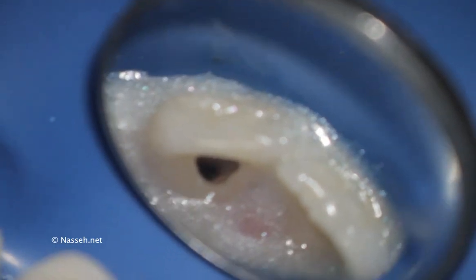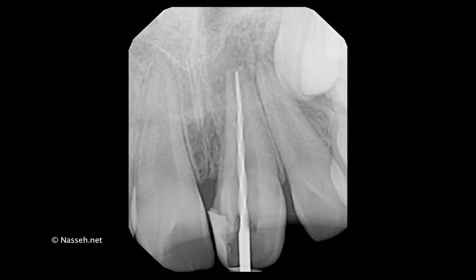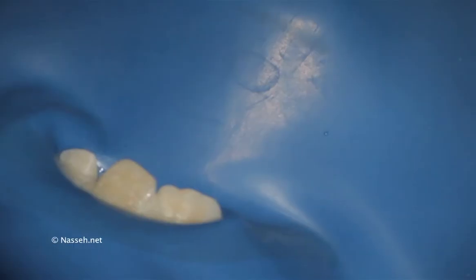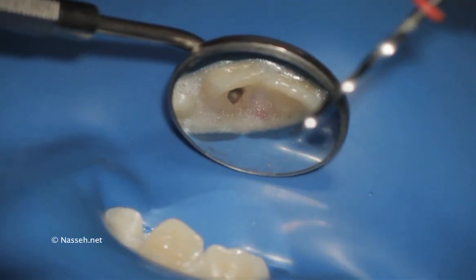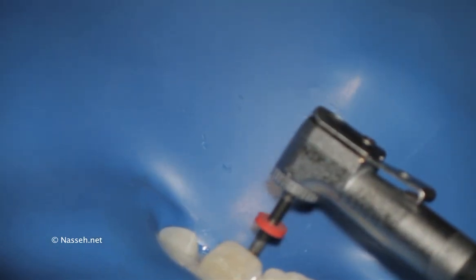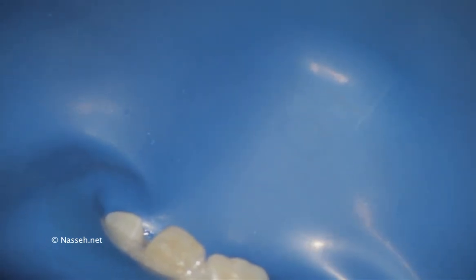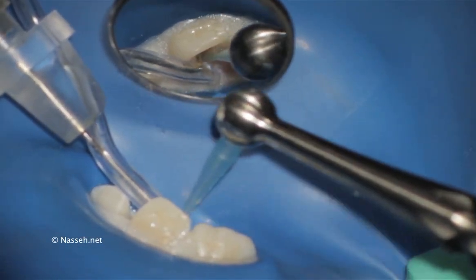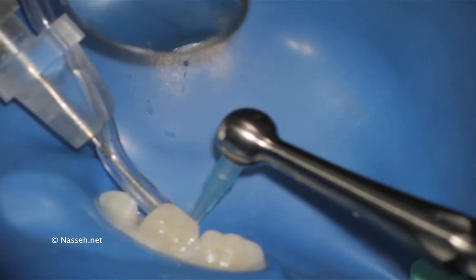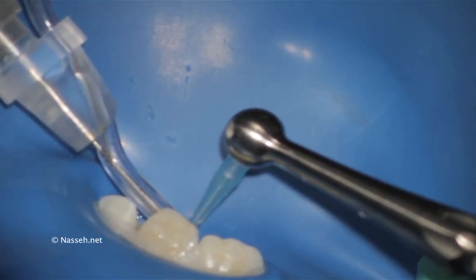Following access and initial instrumentation, a size 40 EndoSequence 04 taper file can immediately reach the apex of this tooth. Radiograph confirms full length. At this point, the apex is completely open, so the 40 can actually reach beyond the apex. However, once the working length is fully achieved and after initial irrigation, here you can see the use of a size 80-04 EndoSequence file, which right after the first use can actually easily reach the apex. I certainly believe that this is an adequate size at this point by going a little bit on the sides laterally and cleaning up.